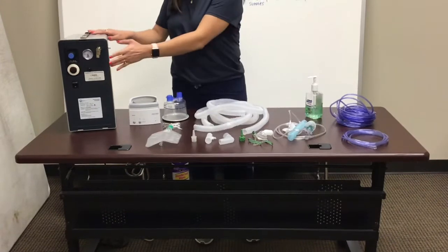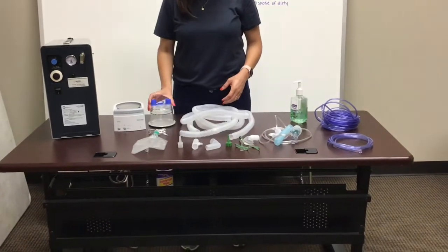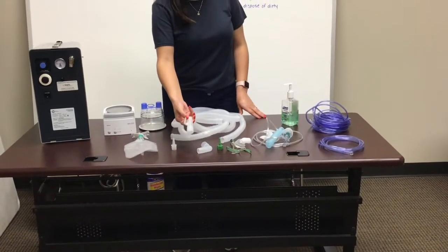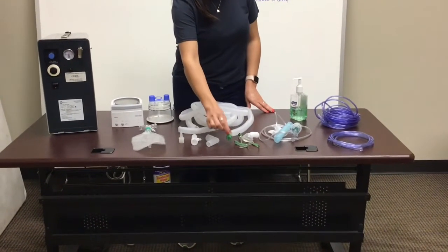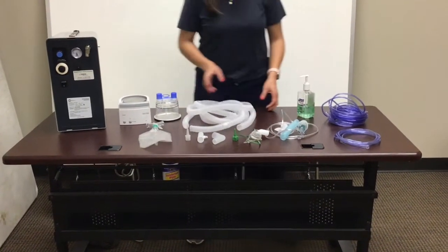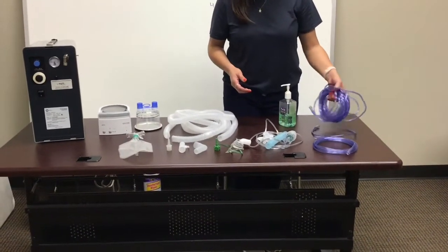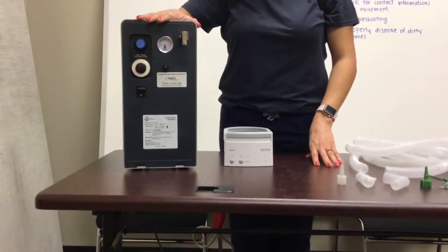First, you will be needing your 50 psi compressor, your heater, your water chamber, your water trap or drainage bag, your concha adapter, your pressure line adapter, which will be used if oxygen is needed, your elbow adapter, your Christmas tree, your trach mask, your corrugated tubing, your nebulizer kit if nebulizer treatments are needed, 7-foot oxygen tubing, and 25-foot tubing.